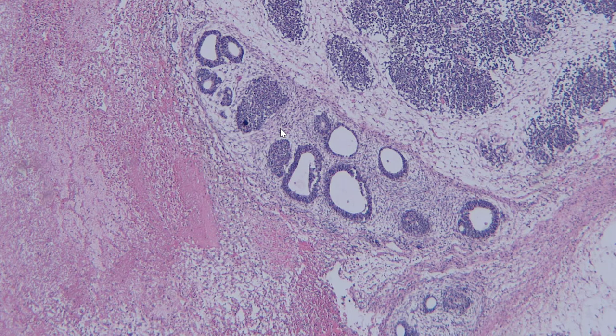Namely, we've got varying components that you can see from low magnification, including these tubule formations or epithelial structures. We've got primitive blue cells over here and also mixed in with the tubules. And separating these components, we have a spindle cell population here.